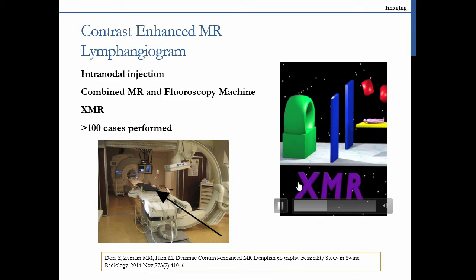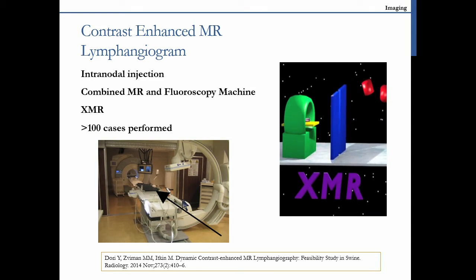Fortunately for us, we have this amazing device that's called XMR. Only a few places in the country have it. I think UCSF, Hopkins, and Northwestern, and us, Children's Hospital, not Penn. This is the table from the cardiac cath lab connected, say, by rails to the MRI.